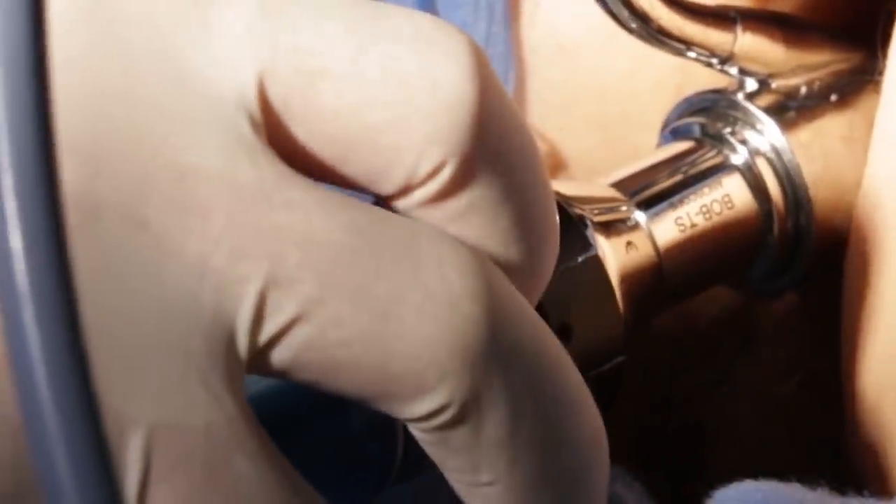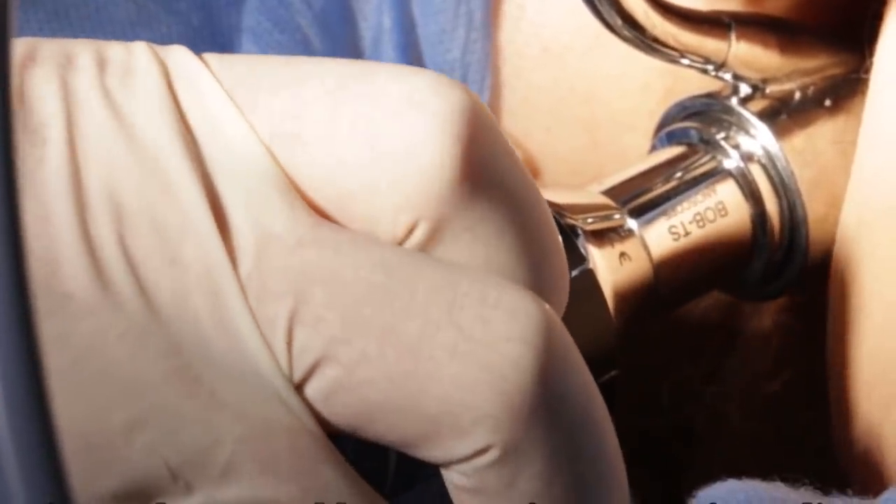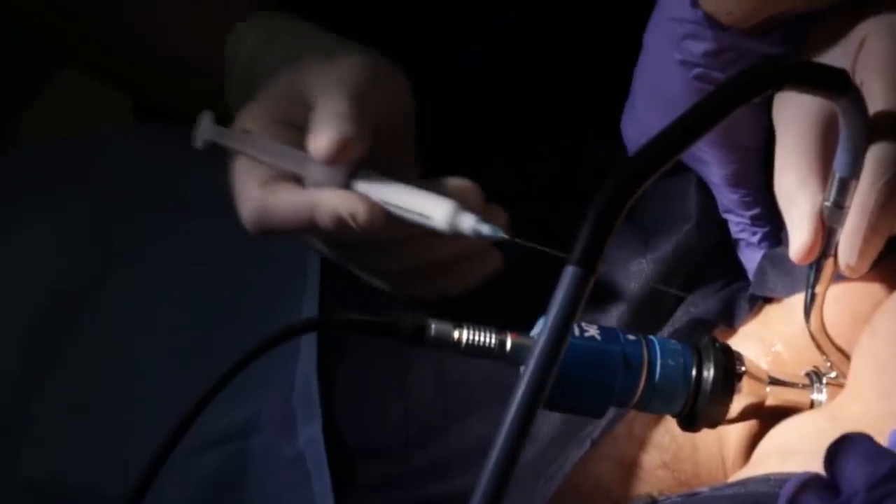After introduction of the video anoscope, piles are located and visualized on the screen. It is very important to make 100% sure that the place of injection is above the dentate line. Twisting the camera allows us to move the needle channel in the anoscope in a circular motion, giving access to each pile we would like to inject.